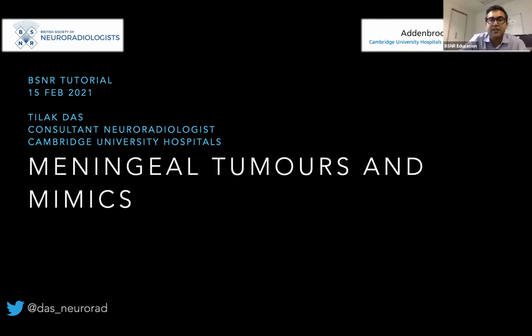Any tips for the diagnosis of intraosseous meningiomas? Oh, yeah. I haven't really mentioned that. I suppose the quality of the appearance of the bone itself tends to be with lots of spicules, but also very sclerotic areas. That's usually fairly obvious, for example, for sphenoid meningiomas, and we've had a few that have been referred to the MDT, thinking it was something else. But when you see the bone, it becomes quite clear. So I think that pattern of sclerosis and little spikes on the bone is pretty helpful. And of course, you may see meningeal thickening on the other side of that bone.